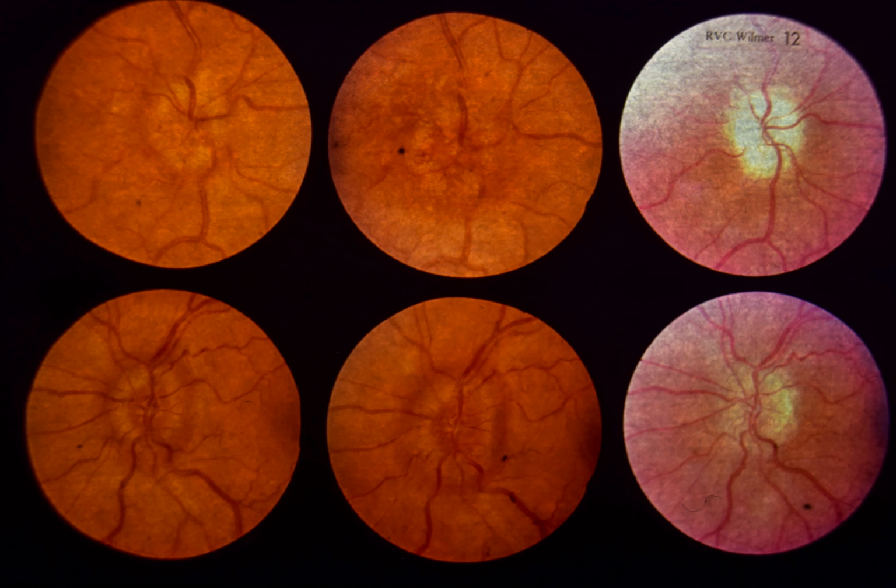After decompression, papilledema has resolved in both eyes. The right optic disc is pale and atrophic. The patient no longer has headaches, but visual acuity is 20/100 right eye and 20/20 left eye with bilaterally constricted visual fields. This patient developed optic atrophy despite subtemporal decompression.